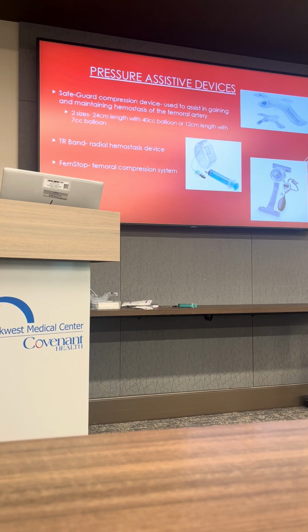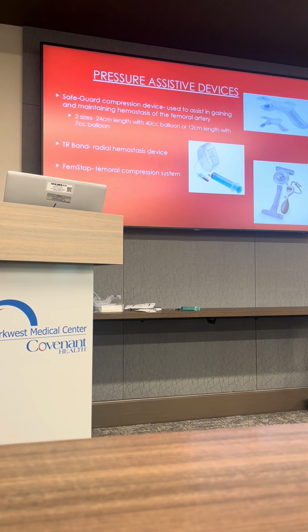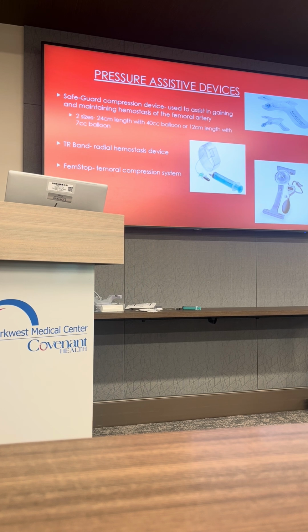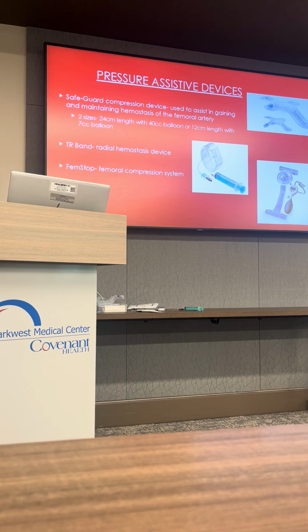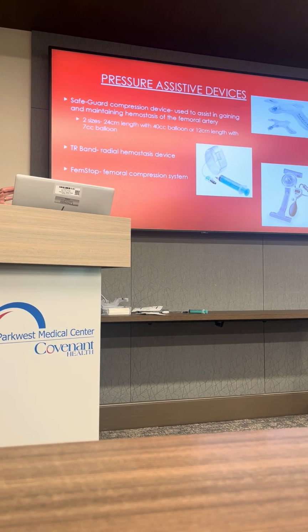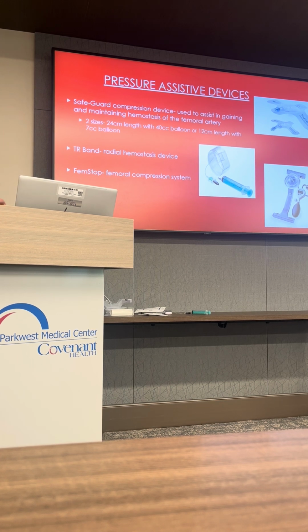I've never used a safeguard. I've used the femstop loads of times. With the safeguard, there's not an adhesive area on that section. No, it's just the white mesh portion of the dressing, and it's one-time use. It's not to be reapplied or anything like that. Technically, all of these are advertised as one-time use and aren't really branded to be reused. I know the femstop, we've taken them off a patient and used them on that same patient again, but it's not necessarily ideal.